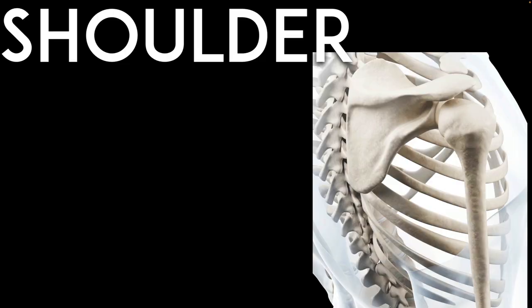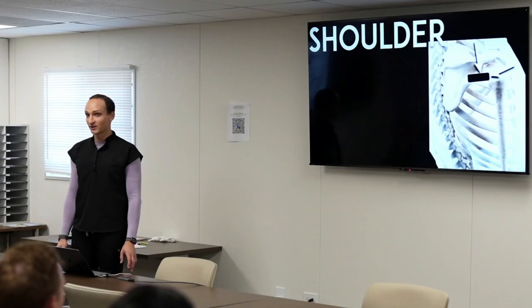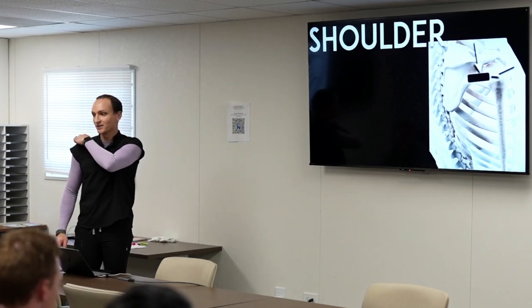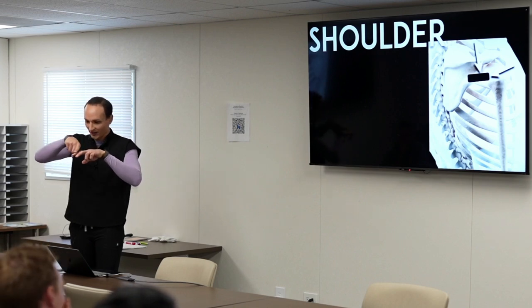Moving on to shoulder injections. Probe placement is identical to the identification view. You can approach in short axis or long axis. I use the short axis when there's a small effusion or for standard injections. For dislocations, I come in from the lateral long axis approach because the humerus is out of the way, making it easier to access the joint space. With the joint in place, the humeral head can get in the way in long axis.